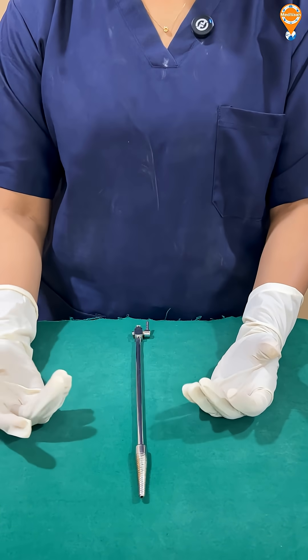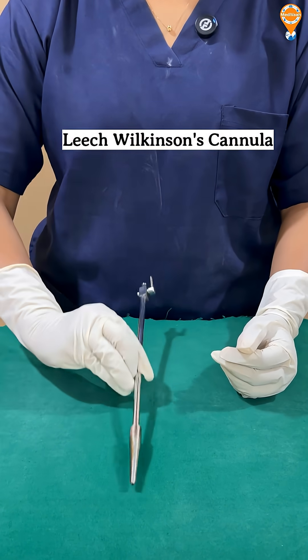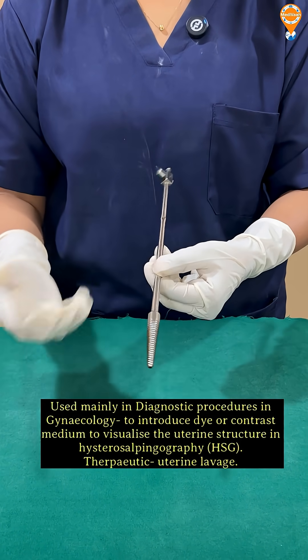The next instrument in our VAIWA series is Leach Wilkinson's cannula. This is basically used in diagnostic procedures, especially in the gynecological department, where we check the tubal patency.